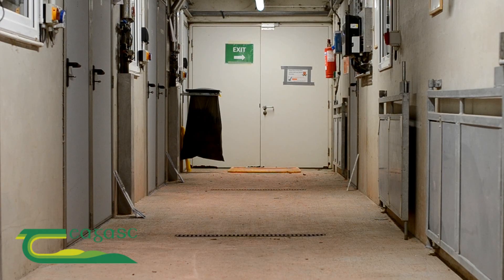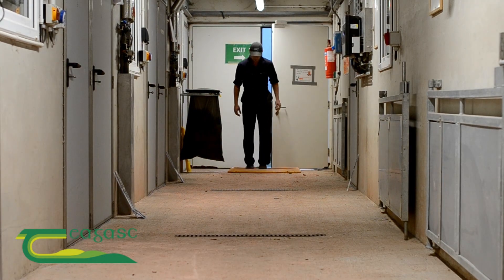Hi, my name is Tomas Ryan, I'm the manager of the pre-research facility here at Moorpark. Today we're going to talk about pregnancy scanning and the type of systems we use here at Moorpark.